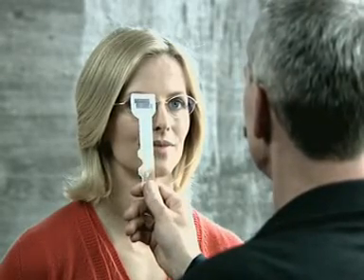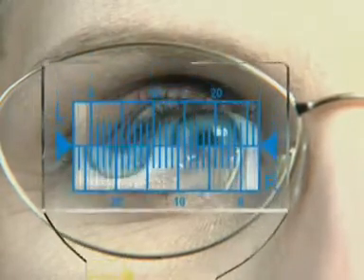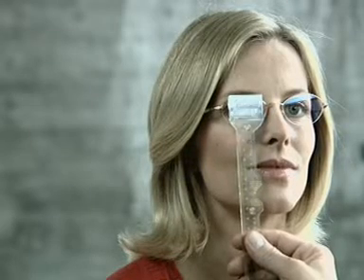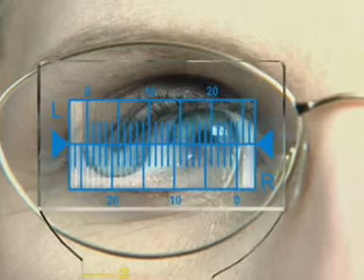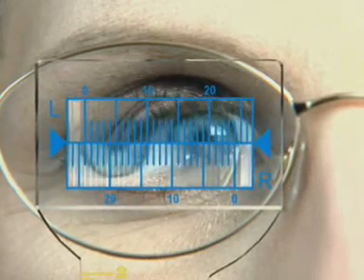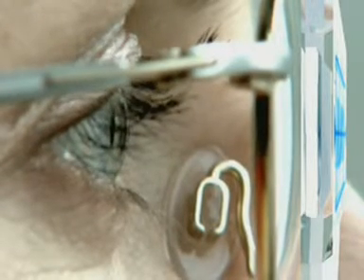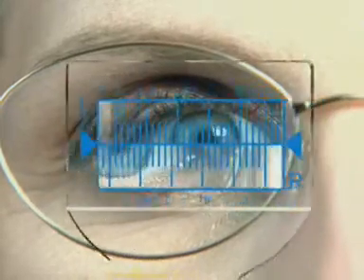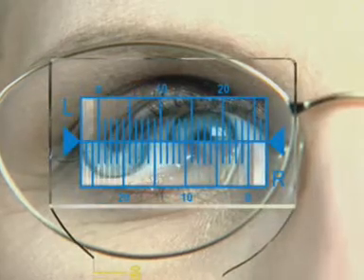First, put the frame plane in a perpendicular position and place the prism ruler flat on the frame. Now, align the blue horizontal line so that it coincides with the center of the pupil. The eye should be looking horizontally straight ahead. The skillful arrangement of the prisms above and below the blue line means that the 2 halves of the iris appear offset with respect to one another. This offset is directly related to the corneal vertex distance. Align the ruler so that either the right-hand blue arrow touches the right-hand edge of the iris or the left-hand arrow the left-hand edge of the iris.